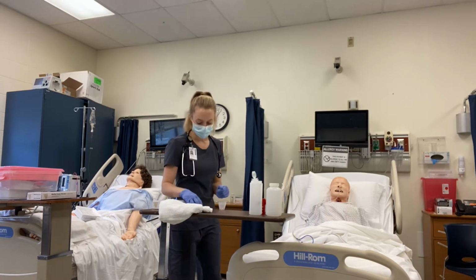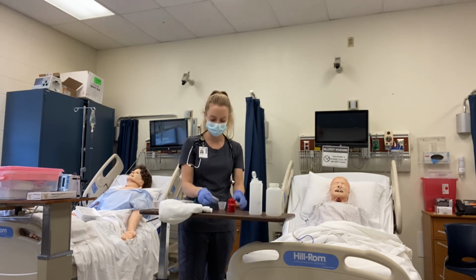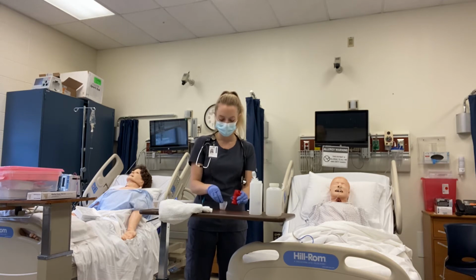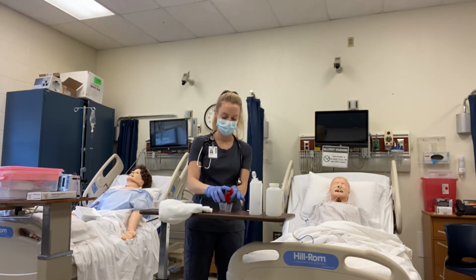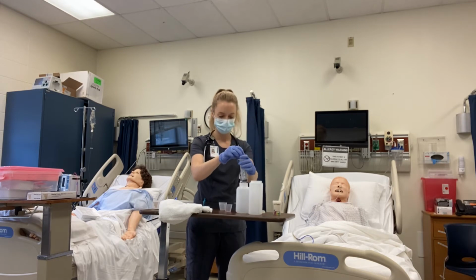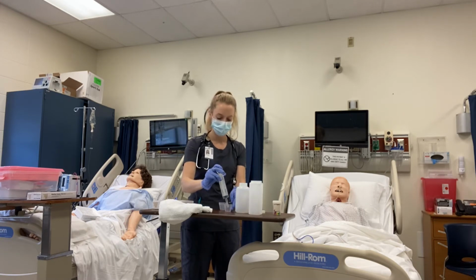I have my medication here. I'm going to go ahead and prepare that. I have a pill crusher here. I'm taking my medication out and putting it in the pill crusher and crushing that. Putting it in a cup with about 20 to 30 mils of water. About 20 mils of water in there, and dissolving that.